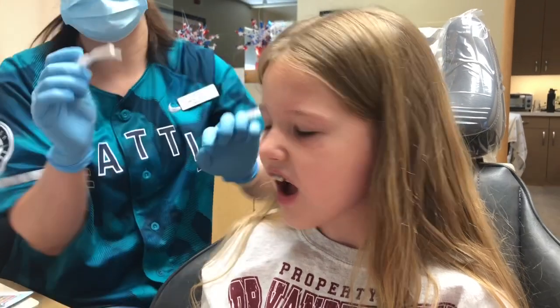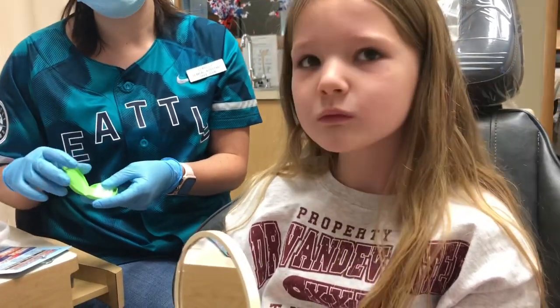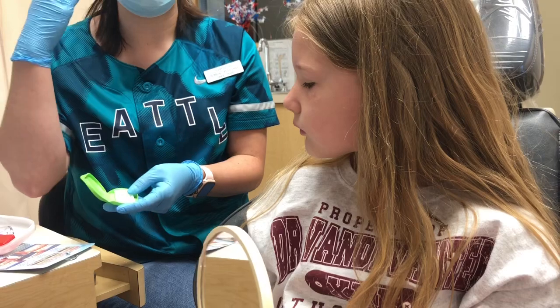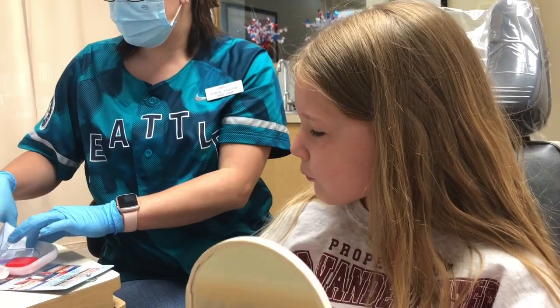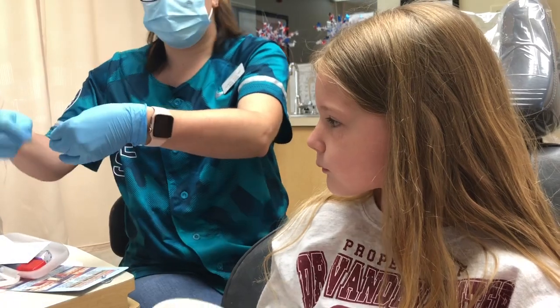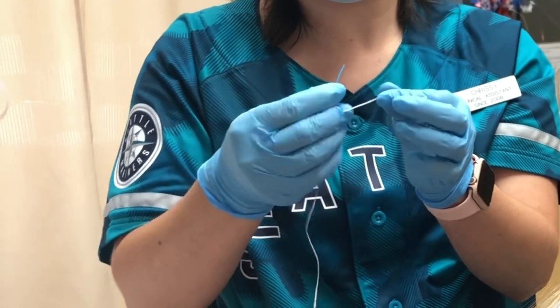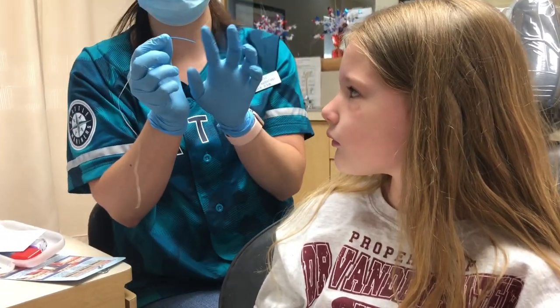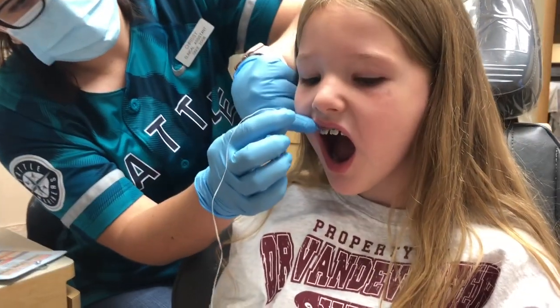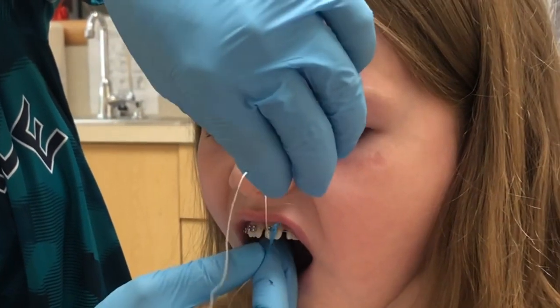So wax — in case she gets anything poking over the weekend. You take a little piece of wax, warm it up in between your fingers, make sure it's nice and soft and sticky, dry out the area that's poking, and then stick the wax on there. Flossing is going to take a bit of extra time, so maybe save some time before bed. Thread it through just like a needle and thread. This is a guide — it's reusable. You just rinse it off, put it back in the package, use it until it breaks. Go ahead and look in the mirror — you're going away from the gums so you don't poke yourself, threading it over and through the wire. And now you can floss.